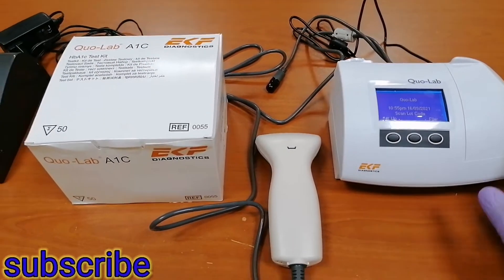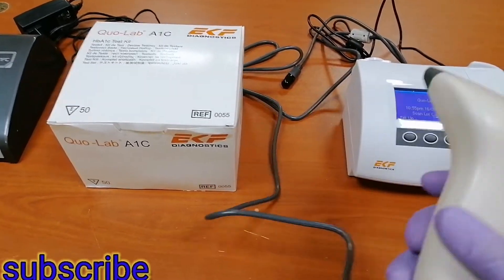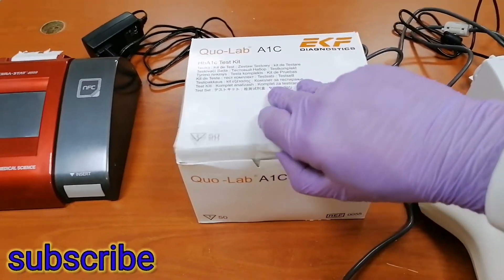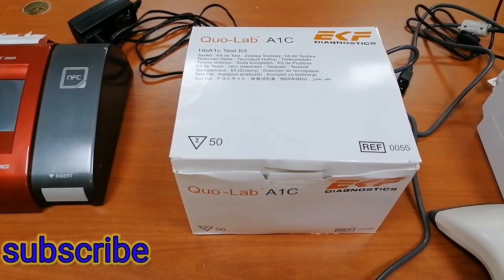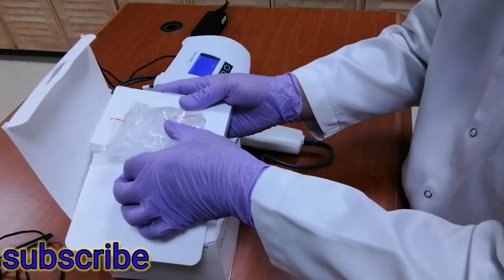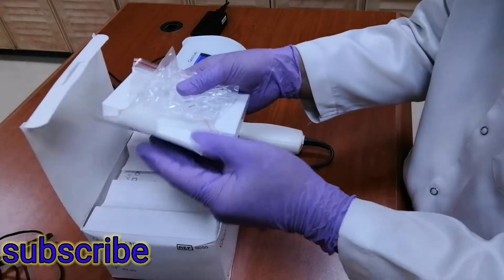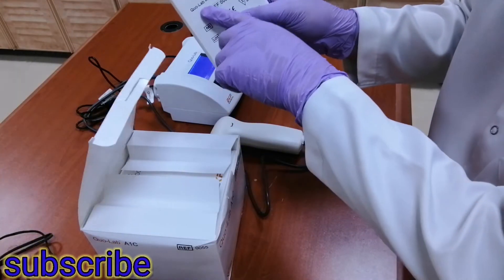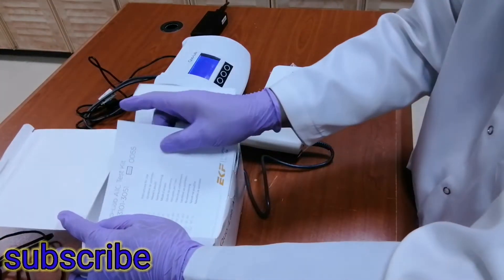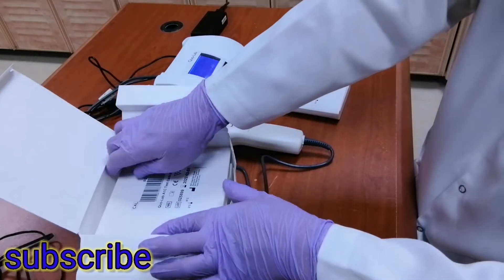So we will see what's inside the box. This is the unit, and then they call this one the barcode reader. Inside the box we also have tips for the blood collector and CoLab A1C sampling sticks, and of course the manual for this machine.